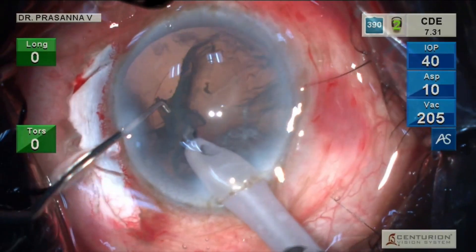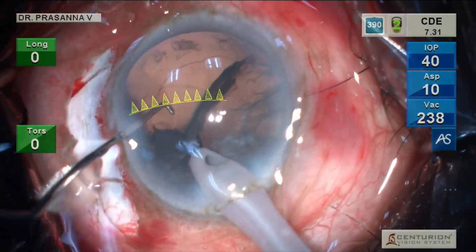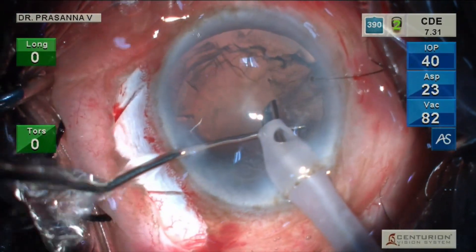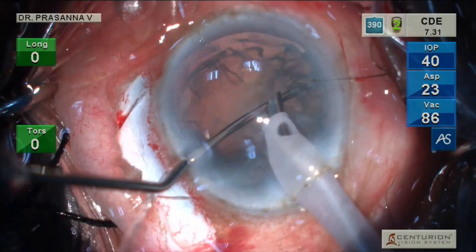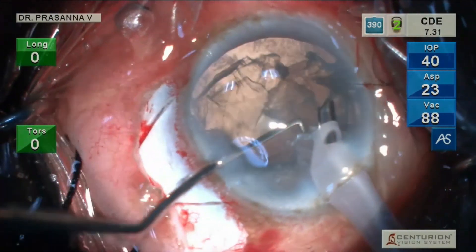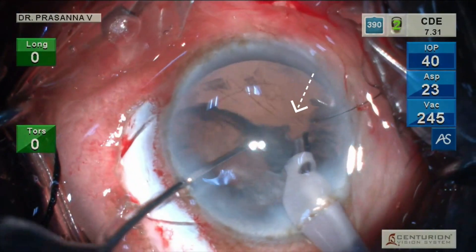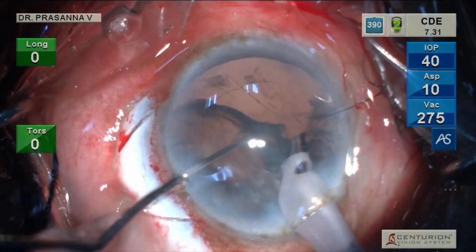This video clip demonstrates management of a pre-existing PCR from an inadvertent lens touch during intravitreal injection. Note the linear posterior capsule tear with vitreous prolapsing into the FACO probe.